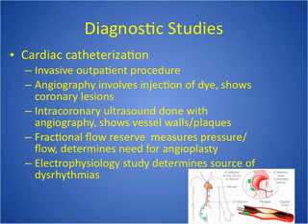EPS, or electrophysiology study, is another thing they can do while they're there, and it looks at the electrical activity of the heart with some electrodes. What that does for the patient is it really helps determine where our dysrhythmia is coming from. And that's done very similar to a heart cath. So when you see EPS study, know that it's invasive and they're going to have that catheter in.